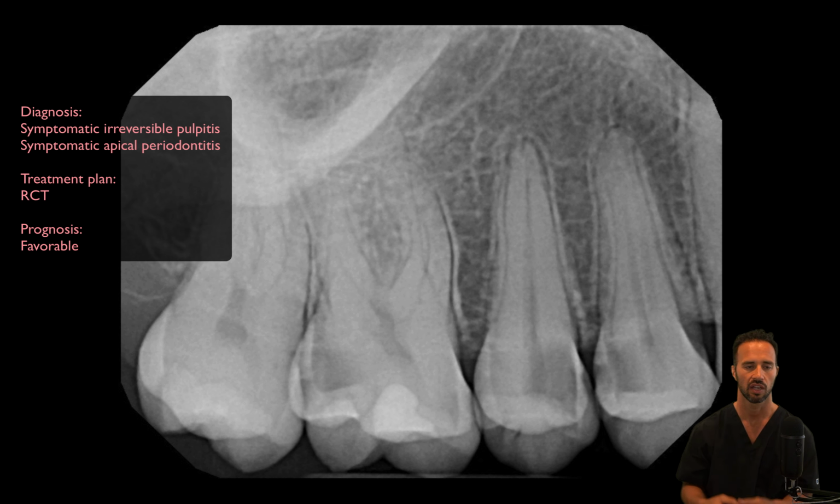to get an airtight rubber dam isolation, because you will not have airtight rubber dam isolation with a split dam alone, because you have so much exposed gingival tissue, and we don't want that gingival tissue that has bacteria to get into the root canal space that we're working so hard to get nice and clean. So this is a great case to demo that for you.